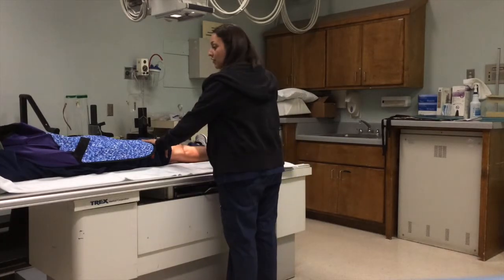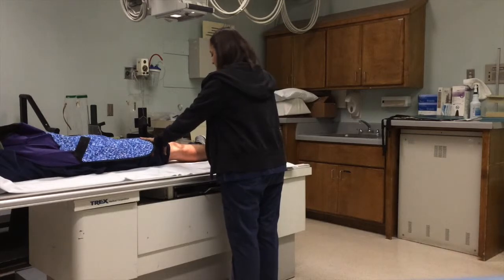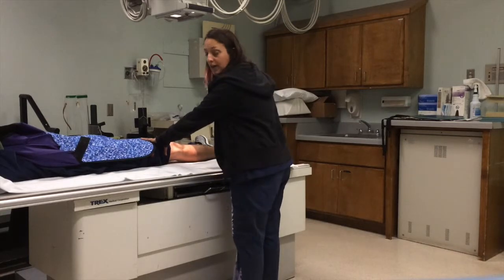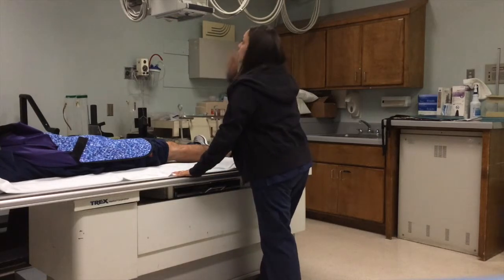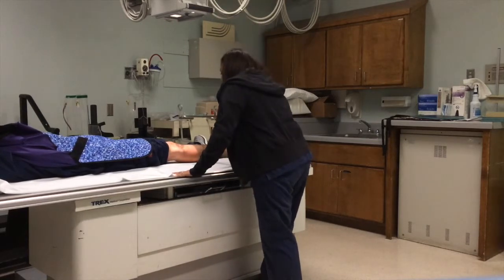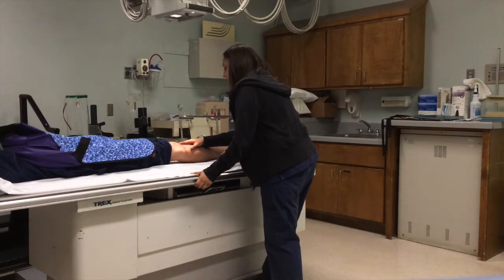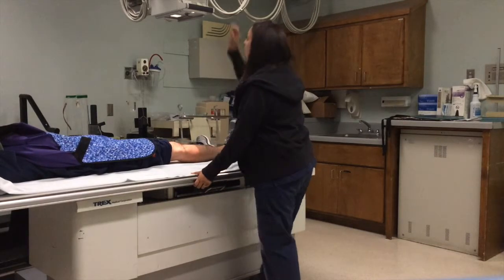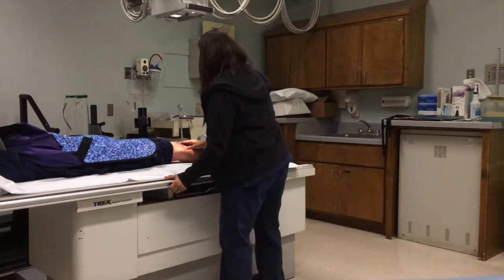So I'm going to have you rotate your leg towards your toe, and then that looks great. It's about a 45-degree angle. I'm going to recenter since we have moved it a little. I'm going to feel the apex without applying too much pressure, just so I can see. I'm about a half inch below. I'm going to collimate to add a little forward.